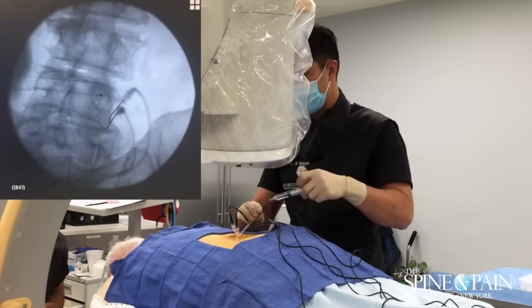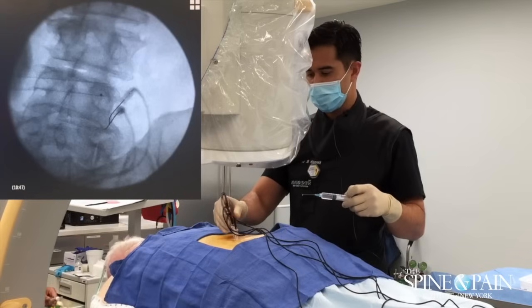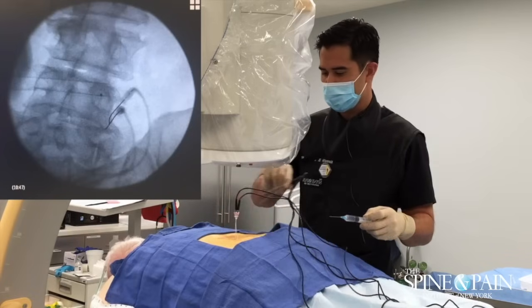The left side is still feeling good, right? Yes, it is. Good. Let's hope that we get some good long-term relief with this.